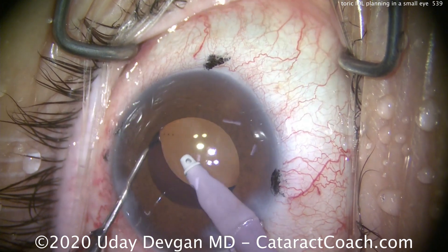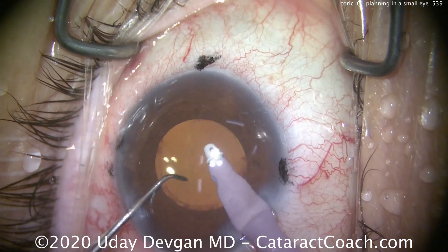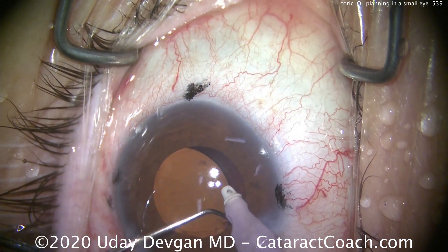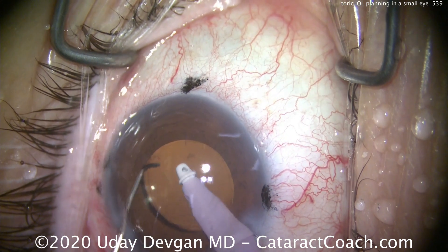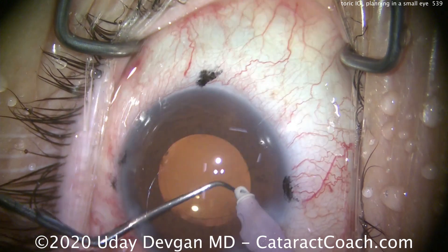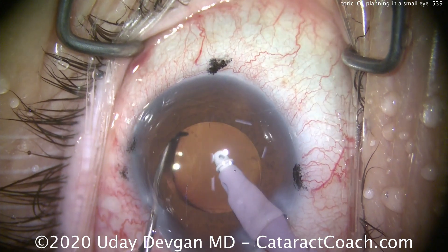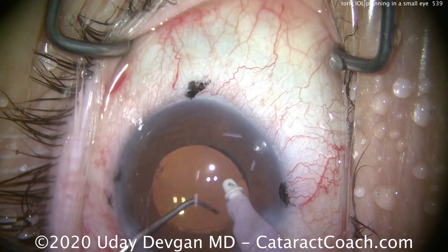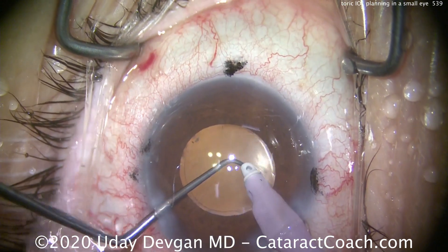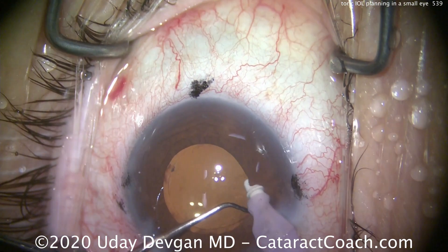Now we can rotate the lens just a little bit more, and we can rotate the other way as well. I'm using a device that's projecting into my oculars — an overlay of exactly where the desired axis is, though that's not shown in the video. But if we simply line up the toric lens marks of the IOL with the toric marks we've made on the cornea at the steep meridian, it's going to be spot on. And so we're doing that — looks great, getting the lens lined up.